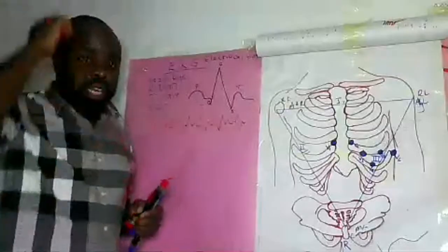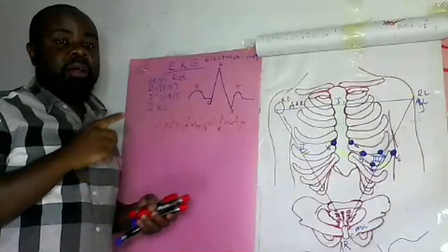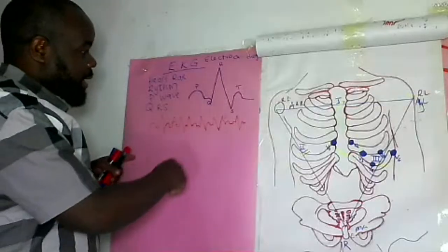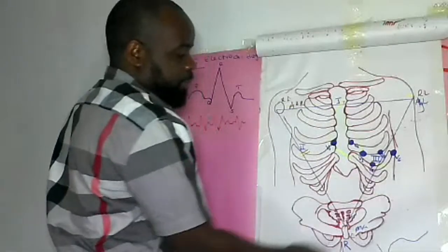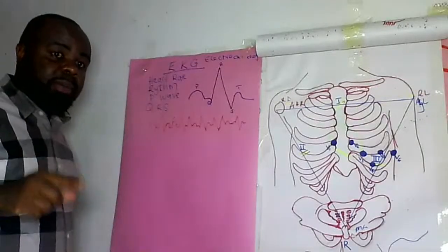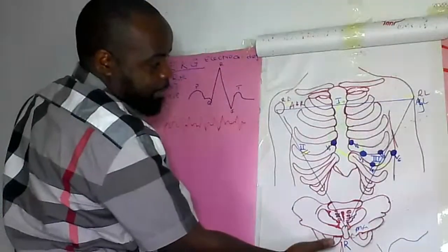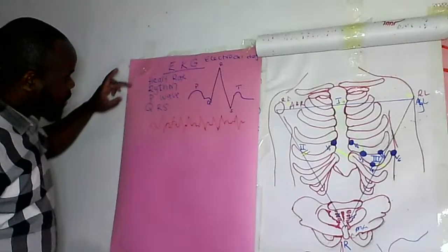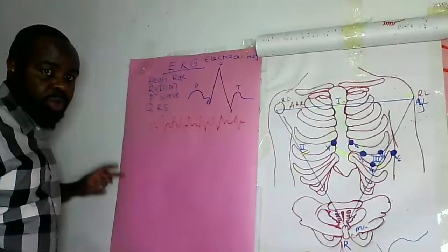You can check your heart rate on a six-second strip of an EKG, with all these leads, lead 1, 2, 3, bringing some deflections. You will always see lead 1, lead 2, lead 3, AVR, AVF, AVL on those strips.